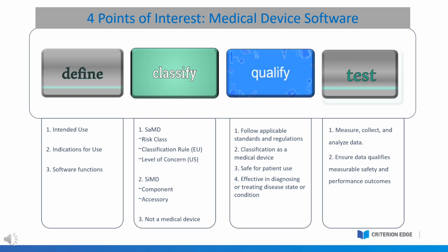Finally, we will use the safety and performance objectives that you defined in the qualification stage to test the device software with the device or as a separate testing measure, apart from the device if it's a standalone software, to prove that it is at least as safe and effective as other software that are aiming to treat or diagnose the same medical condition, or in other words, have the same intended medical purpose.